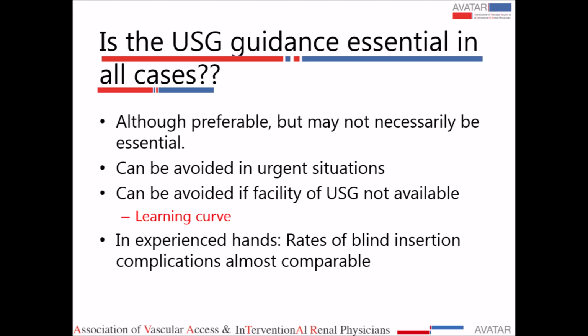And another situation: if you are inserting a catheter in the subclavian vein, then again it is not mandatory to use ultrasound guidance, because it doesn't give a good view of the subclavian vein. It is mandatory for IJV insertion, but not for subclavian insertion.